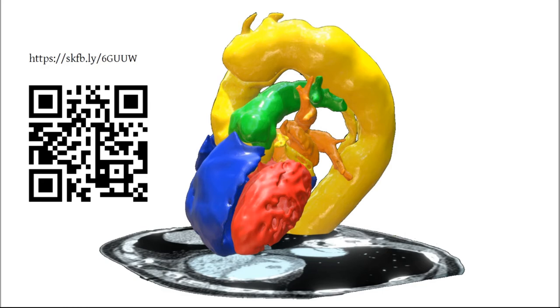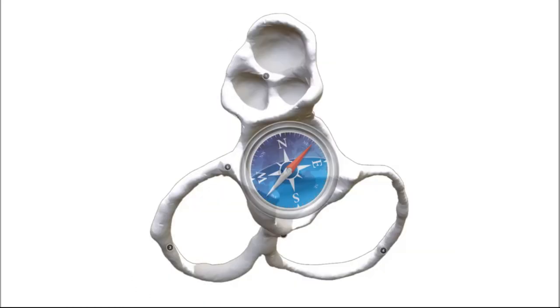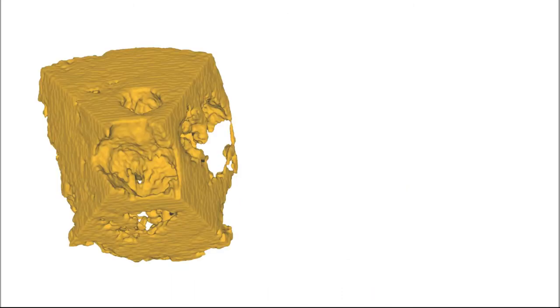So I will look at where the pulmonary veins are in relationship to the IVC and SVC. So you can see whether you have a sinus venosus ASD, and why you have to go past the bicaval view and keep turning to get the right pulmonary veins. So you go to 90 degrees and then you keep rotating, and then these come to view. Because your bicaval view is there, and then you keep rotating right to catch the pulmonary veins.